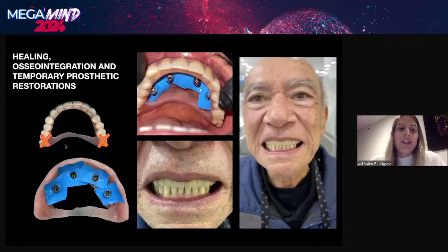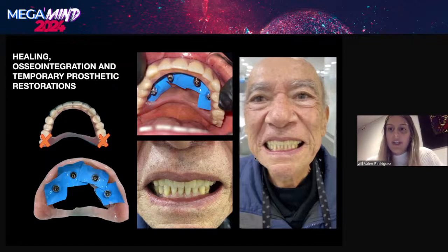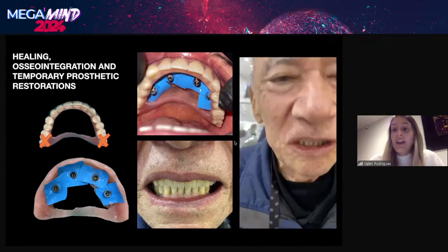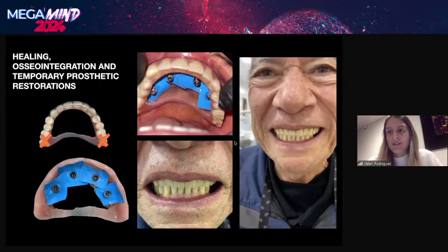And then here you can also see how we cut the prosthesis, because we don't want a long cantilever. And then you can see the final result of the immediate prosthesis in the patient. You can see how he's smiling, how happy he is because of the result.